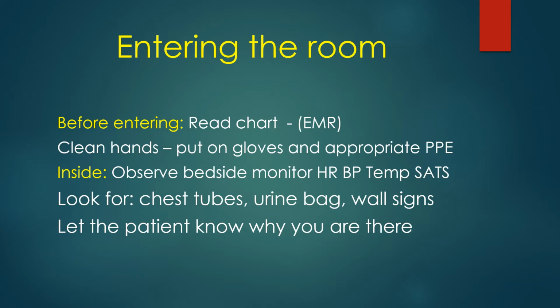You want to talk to the patient. If the patient is not responsive, if he's on the ventilator and he's chemically paralyzed or heavily sedated or comatose or whatever, I still like to talk to the patient anyway. Let him know I'm the respiratory therapist and I'm checking your ventilator or something like that.